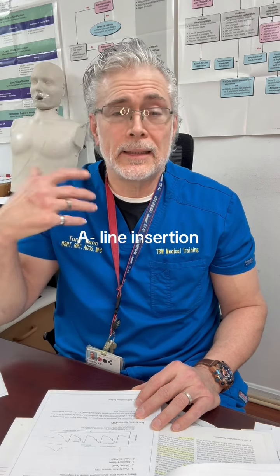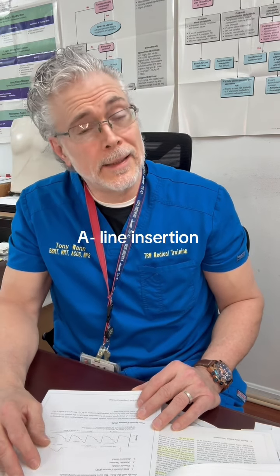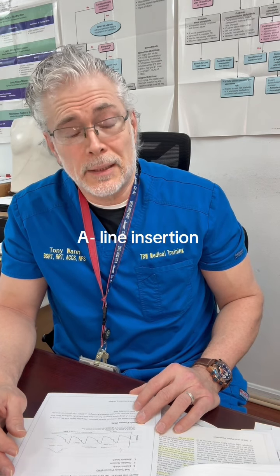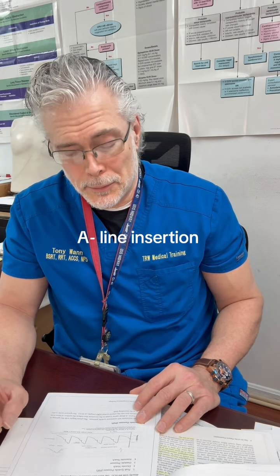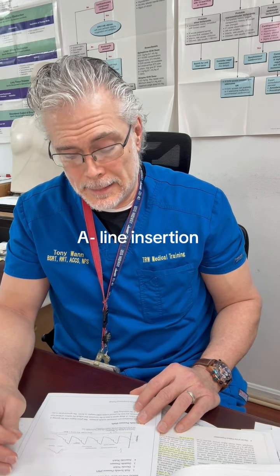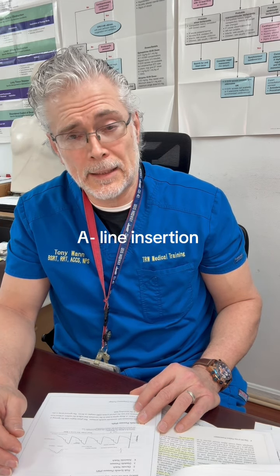But when you understand the waveform, we're going to study that, what the waveform means. For example, peak systolic pressure, what does that look like on the waveform? Dicrotic notch, diastolic pressure, and that kind of thing. And the anacrotic notch.